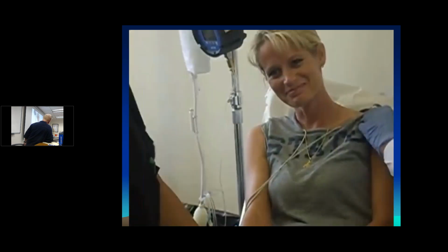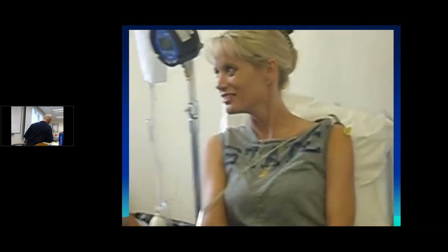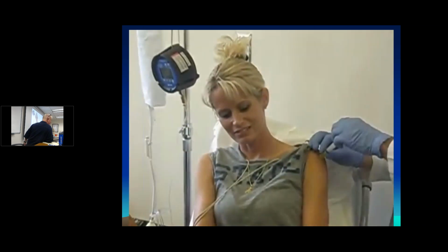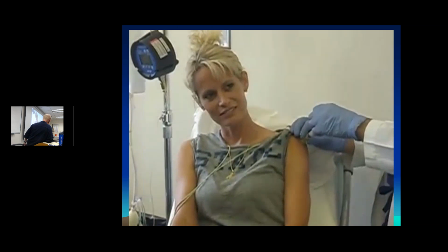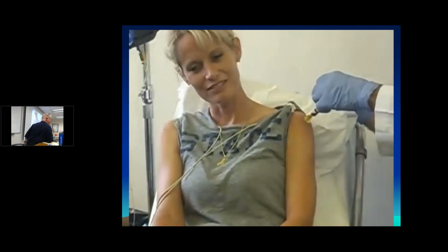So the other thing that maybe you can't see is that it's not butted against the skin. He stops at that black mark. Is that recommended? Yeah. Will you feel the pressure release right here, the drill change? Typically, it will go hand in hand with those marks, but the marks are a more accurate way of knowing where you stop it.